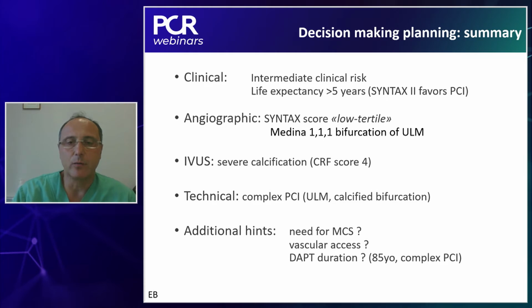Let's move one step forward, and we also try to address one of the points raised by the colleagues. How would you guide your procedural strategy just based on angiogram? But actually, you already addressed this question. This is really a case where we should try to do intravascular imaging. And you nicely showed that with the IVUS, you could even cross these tight stenosis. One of the colleagues, it was actually Irene, said, didn't you decide to predilate the tight lesion on left main before doing IVUS?